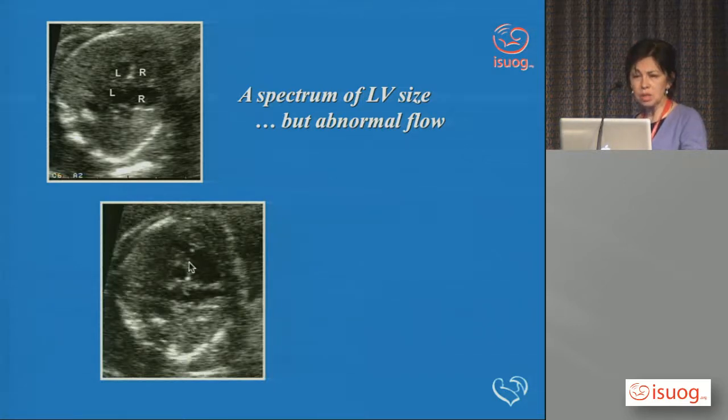And this is just a slight tilting of the transducer, and that comes to the point again that you should not always look at the picture from one particular angle. Take a look from a side view or just move the transducer slightly, because this is the same fetus. And then as you move a little bit more, you can see that actually that ventricle here doesn't go all the way down. And if you look back, perhaps you just see here the right ventricle going around and forming the cardiac apex, which is one of the hallmarks of hypoplastic left heart syndrome.